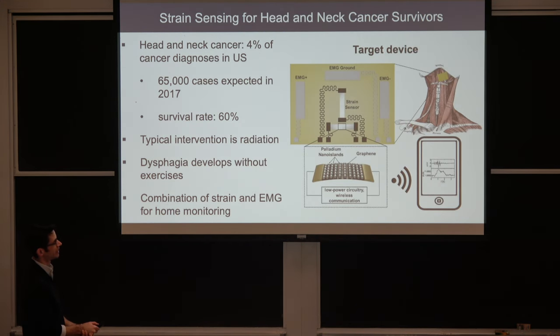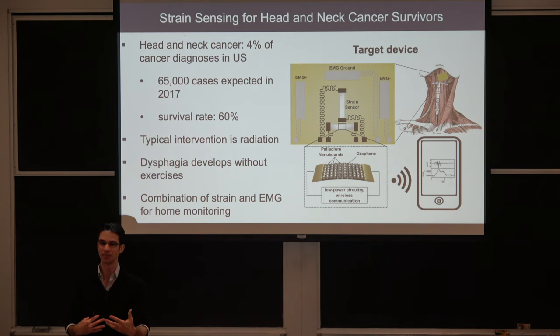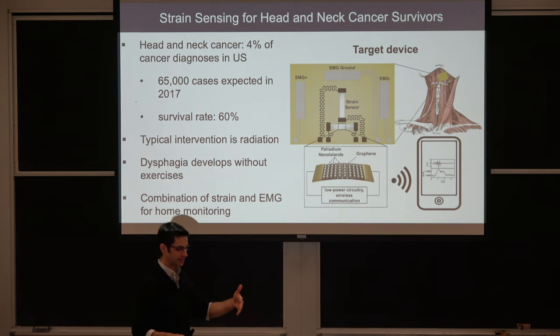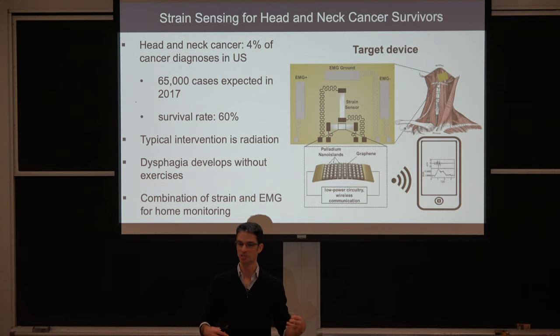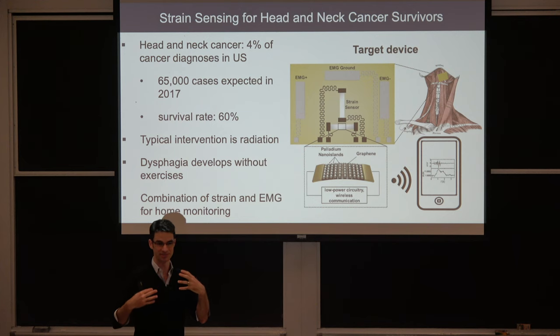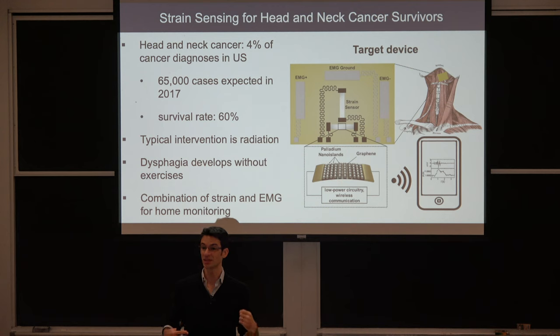So the goal was to develop an app that would grade your performance and also monitor your swallowing activity over time using a device that was unobtrusive, and maybe you couldn't even feel it on the skin. Now, the standard of care to measure swallowing activity is a barium swallow test, where you eat this gross paste that has a lot of barium in it because it's a heavy element, and you do in vivo x-ray fluoroscopy, where you get a video x-ray of your oral cavity and esophagus while you swallow, and you can measure dysphagia. Now, if we can get data that are even close to as good as that at home, that would be way better, right?